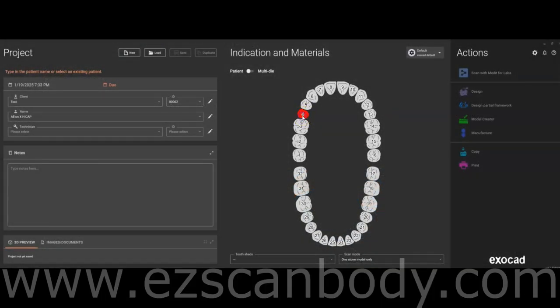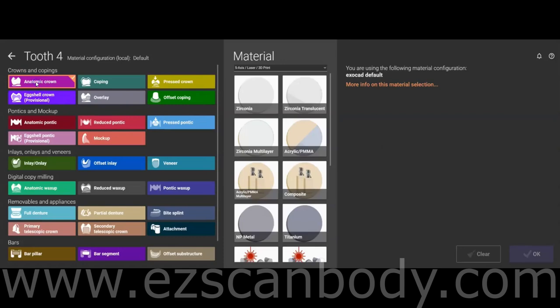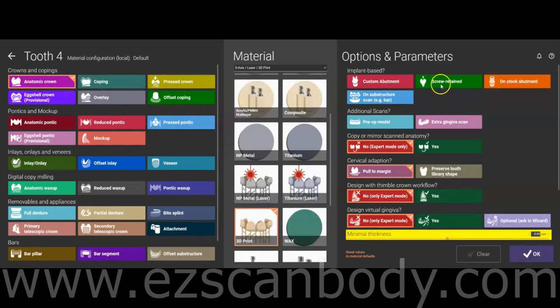In ExacadDB, select the anatomic crown option with the implant-based screw-retain setting. This allows us to work with the scan body and jaw scans separately. For cervical adaptation, if you have implants, choose Preserve Tooth Library — this is important because the tooth number often doesn't match the implant's position.